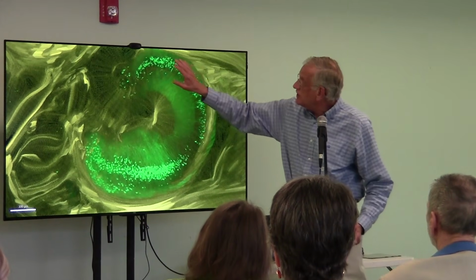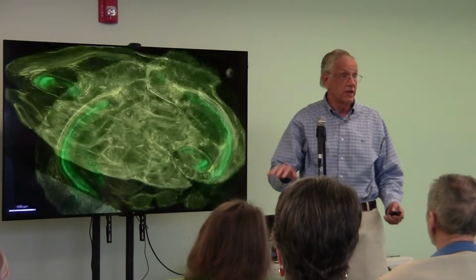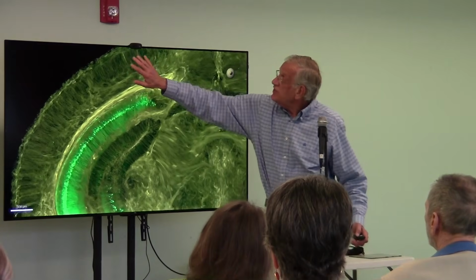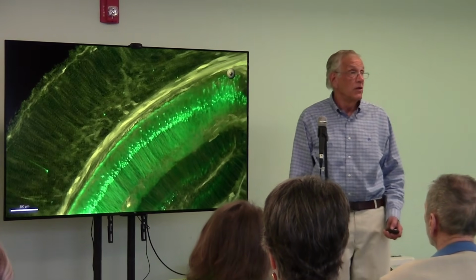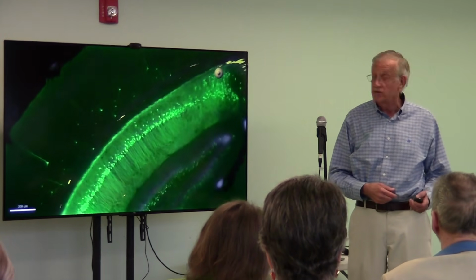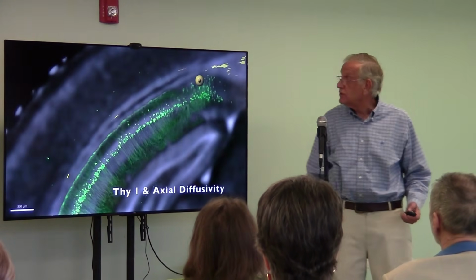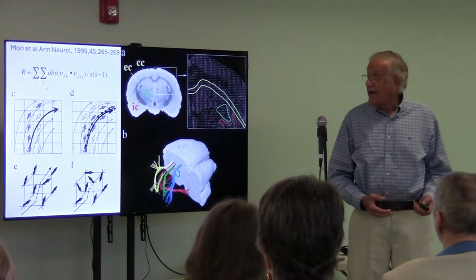This is hippocampus again, all the cells, and the dendrites, the axons, pointing toward the center. If I go out, now I'm seeing these that are derived from the MR. Those are tracks that we're seeing at 5 microns. 25 million times higher resolution than the clinical scan. These are the light sheet. These are the axons. So that's diffusion tractography.